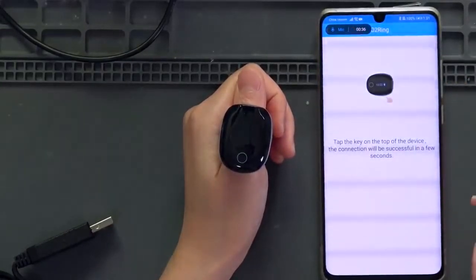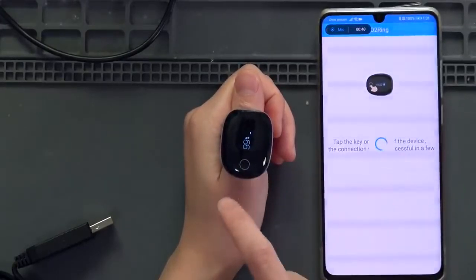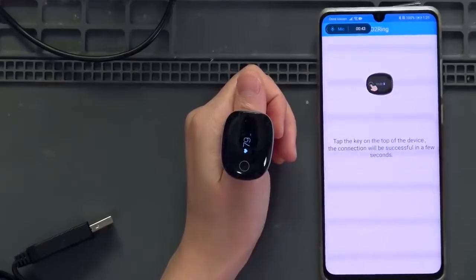So now it shows up — this is my O2 ring. Tap the key on the top of the device; it is very responsive right away.